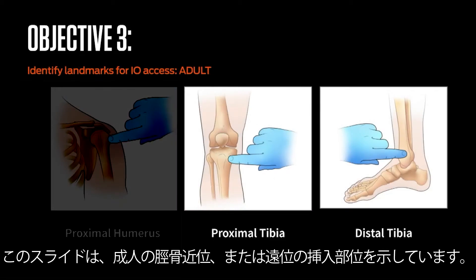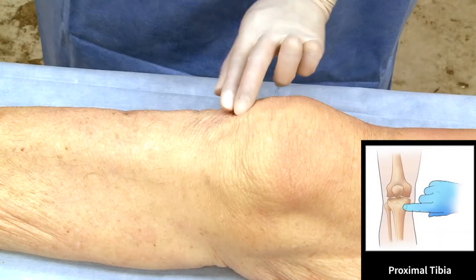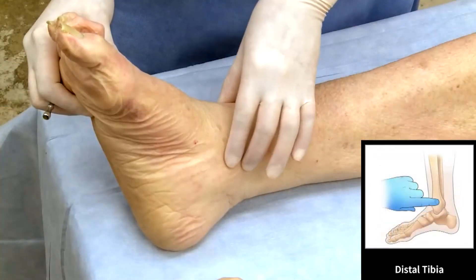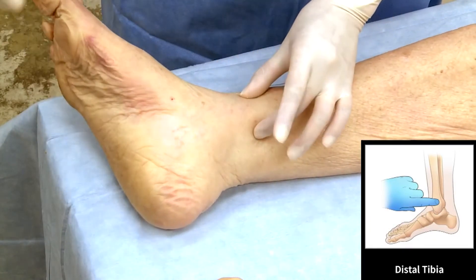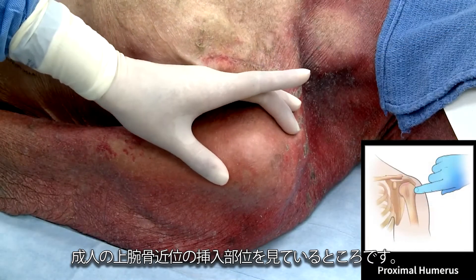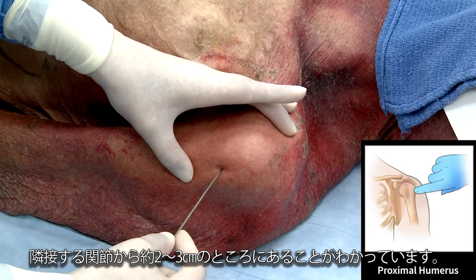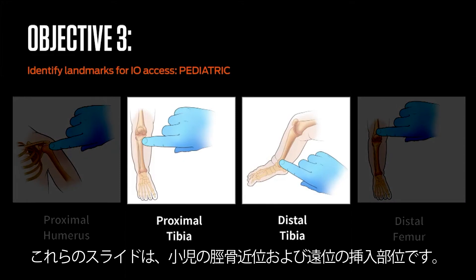This slide illustrates the adult proximal and distal tibial access sites. Note that each site of the adult tibia is located medially and approximately 2–3 cm from the adjacent joint. Looking at the adult proximal humeral site, we note that the proximal humeral site is located laterally and approximately 2–3 cm from the adjacent joint. These slides illustrate pediatric proximal and distal tibial access sites.